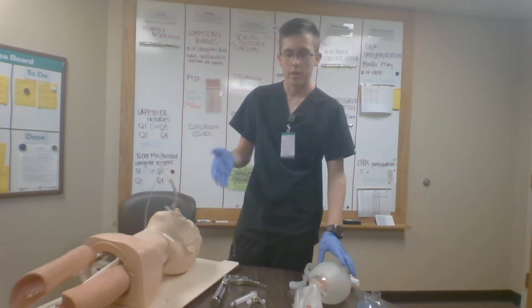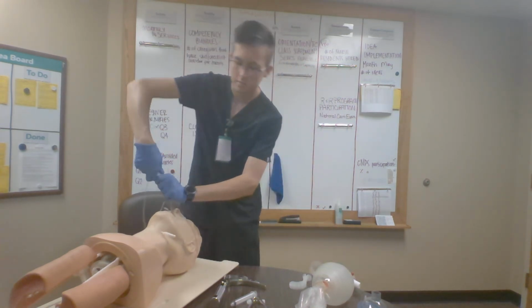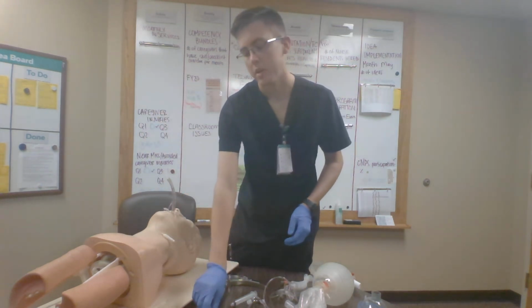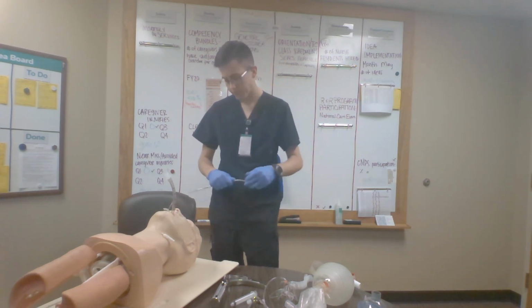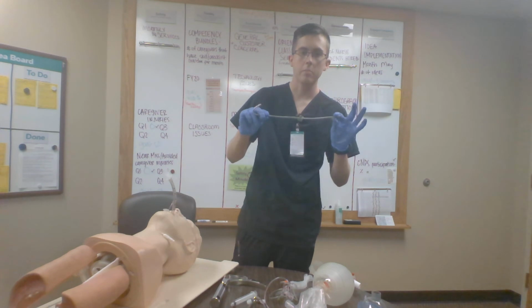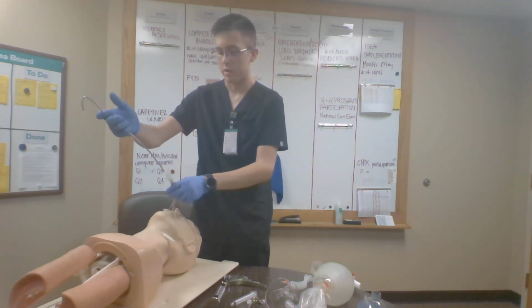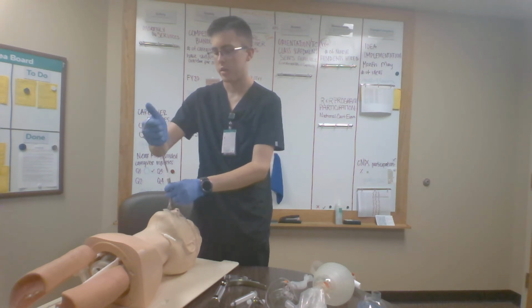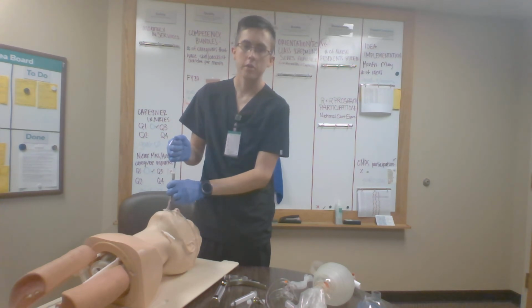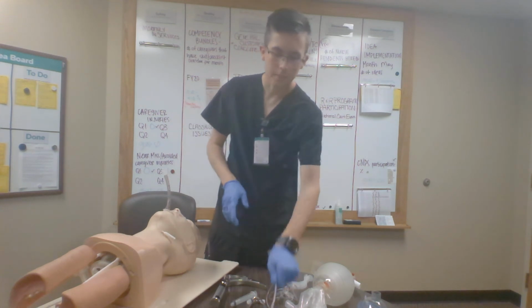Say that throughout my route to the hospital, I noticed that there are some secretions that begin to start going into the airway. So what I would want to do is grab my flexible tip catheter. To begin to suction, I'm going to represent my stylet as my flexible suction catheter. I want to go ahead and insert into my ET tube, cover the suction port, and then slowly suction on my way out.